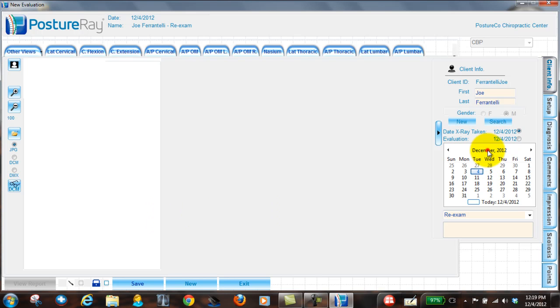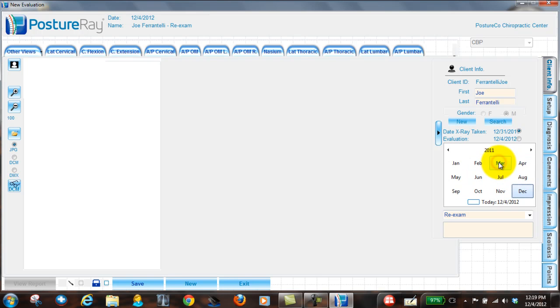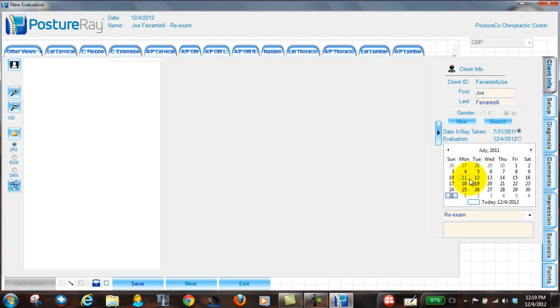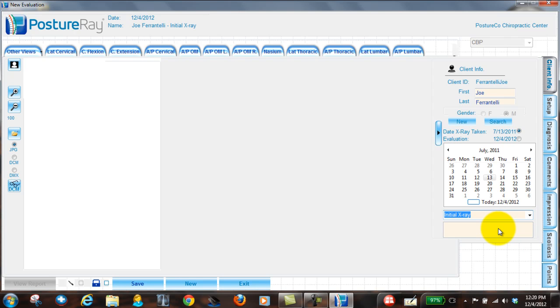The date on this film, we're going to say it's July of 2011, and I want to say it was the 13th. Now what type of exam do we want to say? I'm just going to say it's an initial X-ray. What date is the exam that we would want to do? Is it going to be the same date of service or are these overreads or are you going back and doing them?